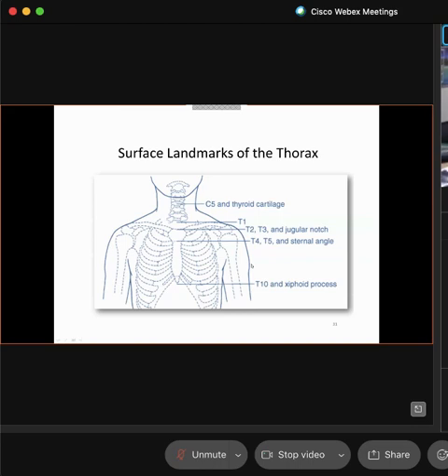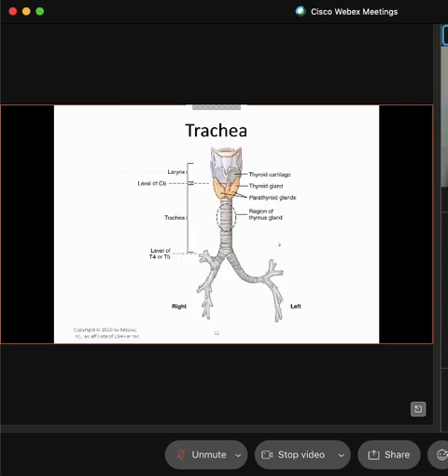That's why touching or palpating the vertebral prominence places you right at the same level of the posterior ribs, number 1. So its significance is so high that if you do not have light or you clip the vertebral prominence, chances are you are clipping what? Not chances are, you are clipping what? Apices. Apices. Good job. Perfect.